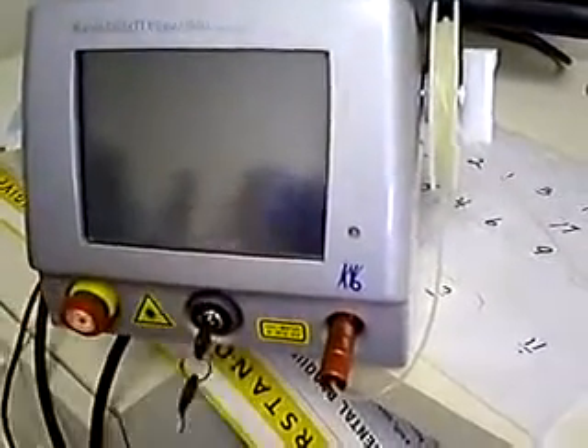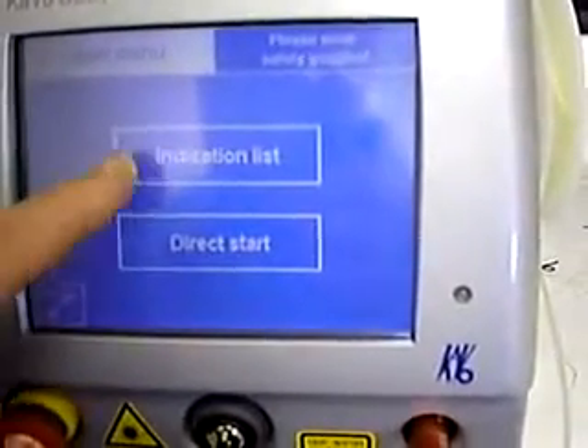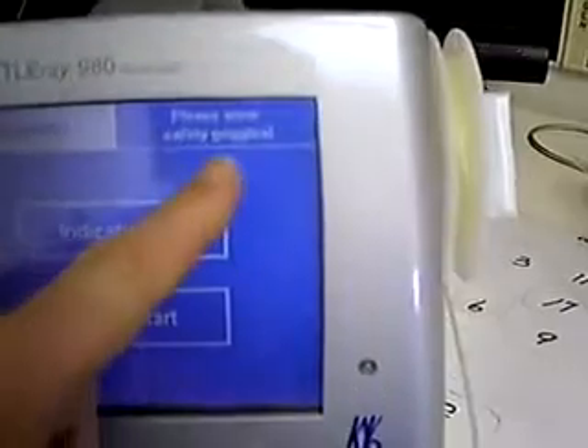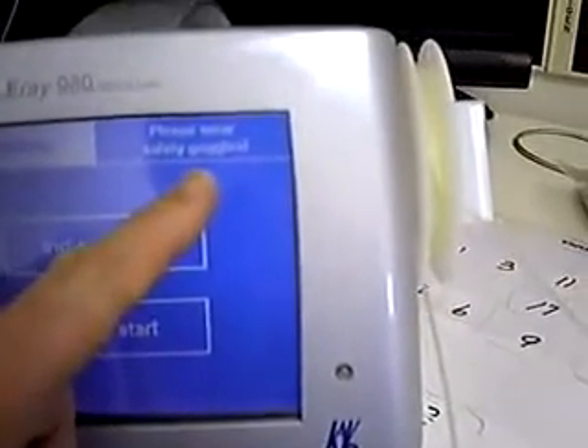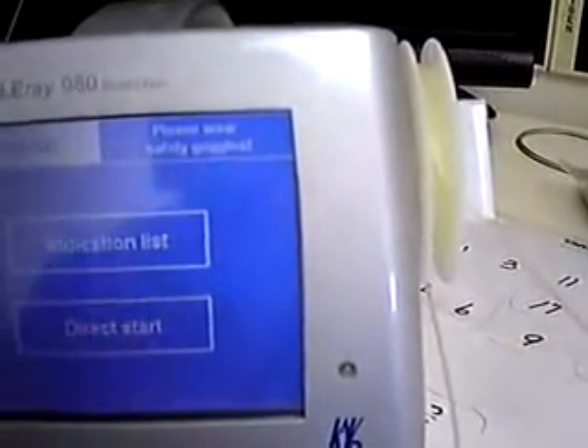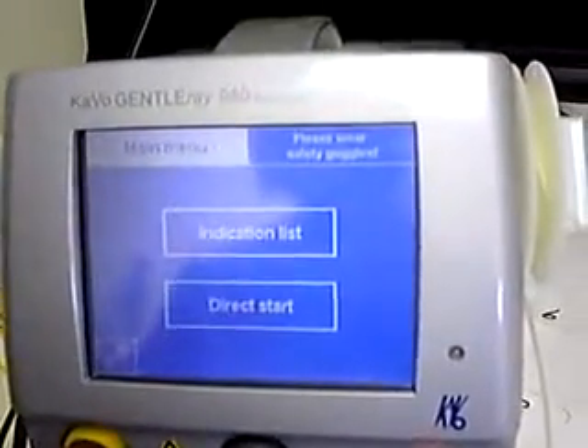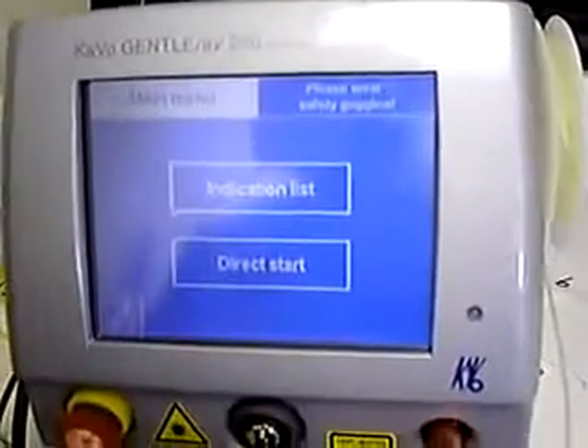Just turn the key and that engages the laser, and you get a nice screen that comes up. You can do a bunch of different things. We're going to start with the indications list, but most importantly, it lists a warning up here: always wear your safety goggles whenever you're using a laser. Especially if you're wearing loupes, you need inserts in order to protect your eyes.